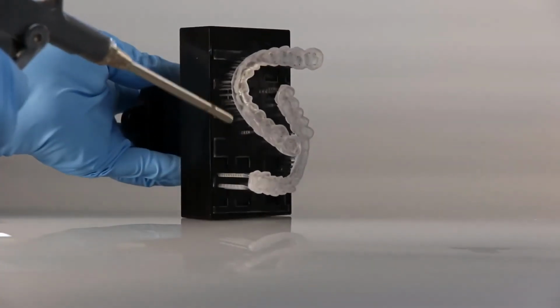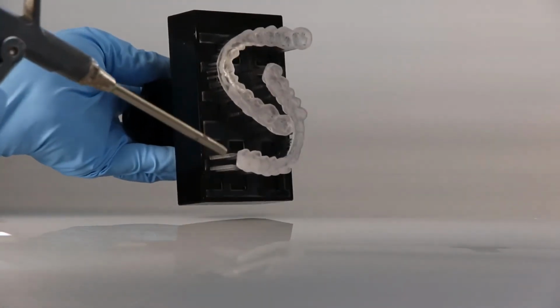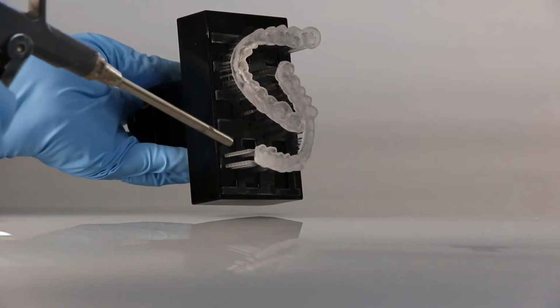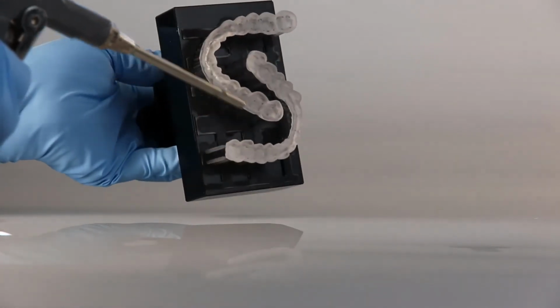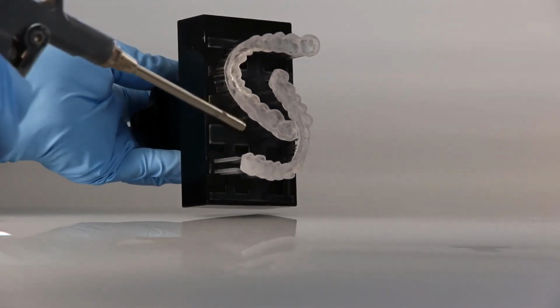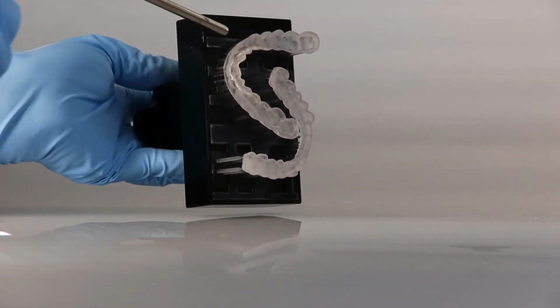After completing the second cleaning, the object has to be blown off again with compressed air and can then be removed from the building platform. Cure it finally in the recommended curing device. Only then do the materials reach their final hardness and thus their properties as a medical device.